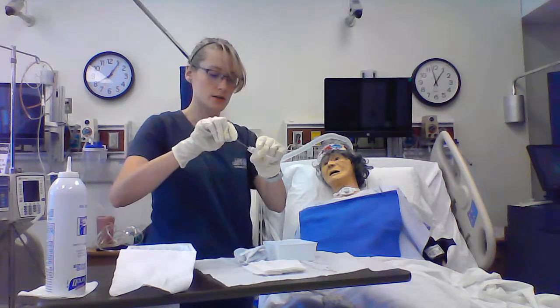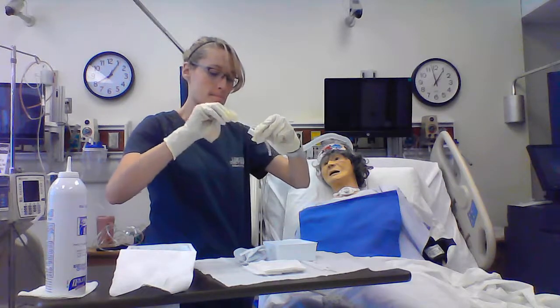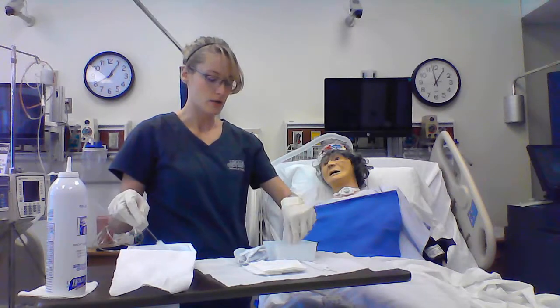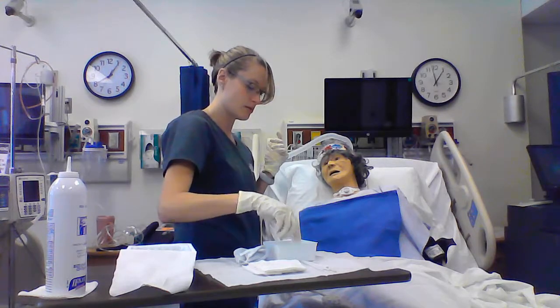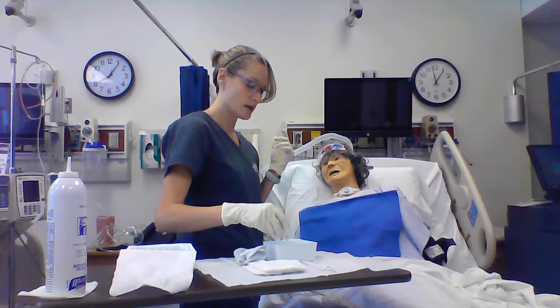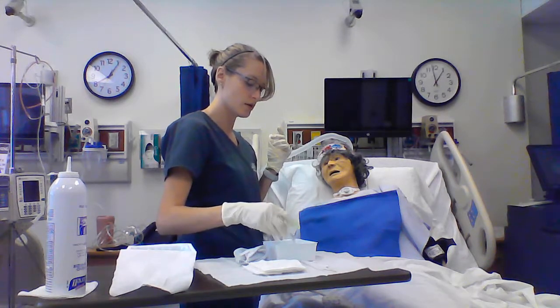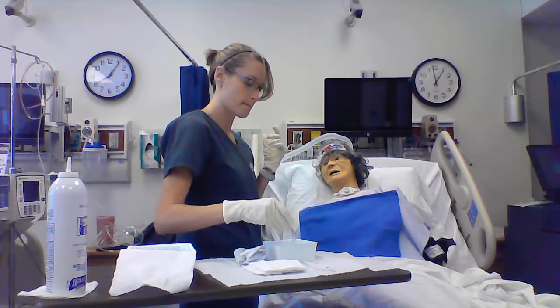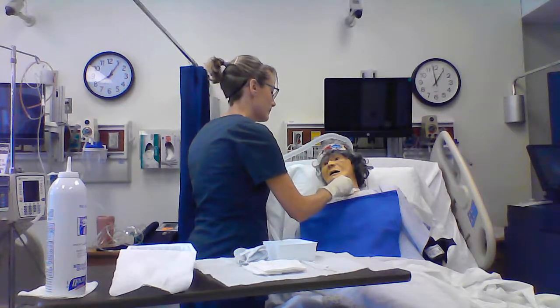So I'm going to brush the inside of this cannula out. Clean it, and then I'm going to soak that in normal saline. Use a sterile hand to grab the cannula. Tap off any excess water because I don't want to introduce that fluid into her lungs. And then use this sterile hand to replace her cannula until I hear it click into place.